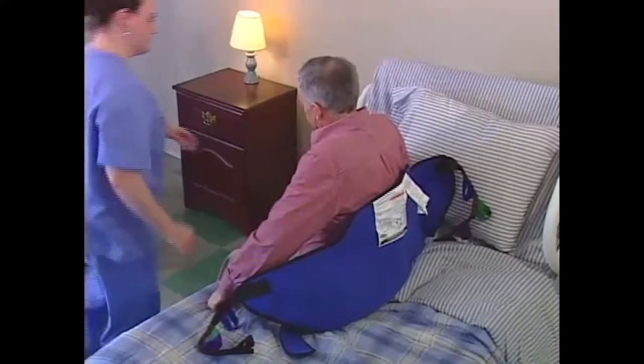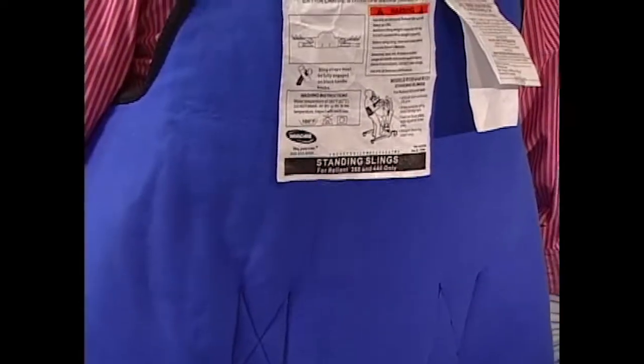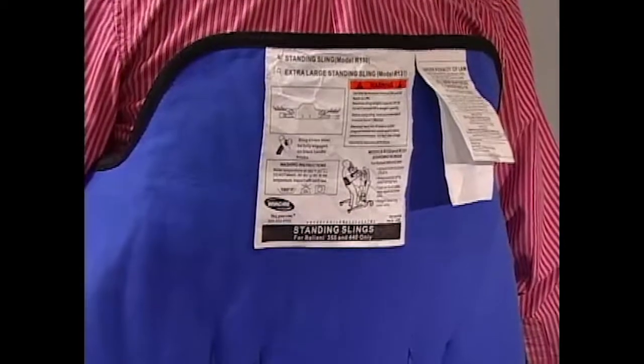is against the resident's body. Position the sling so that it is at the base of the spine and under the arms to a point just below the shoulder blades.